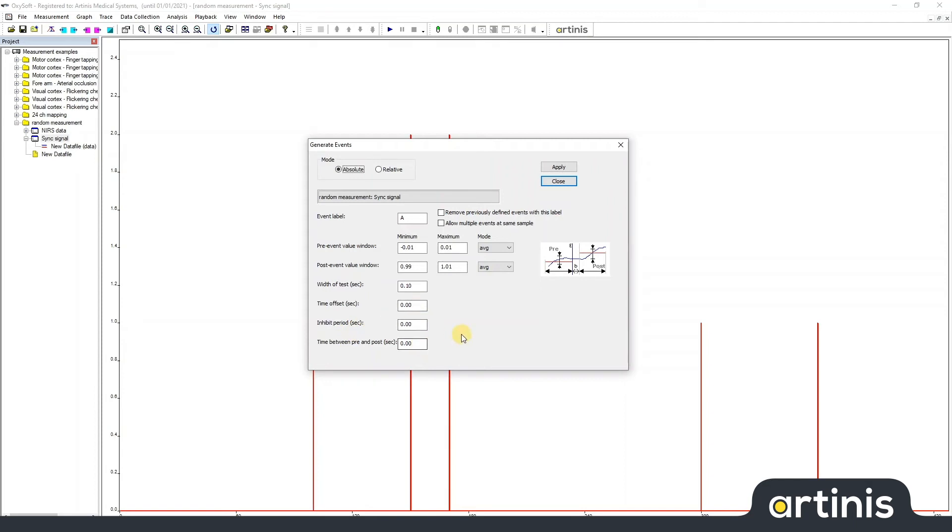These other values can be found in the manual for more explanation. These can be used if you want to use a more sophisticated signal for your event detection.